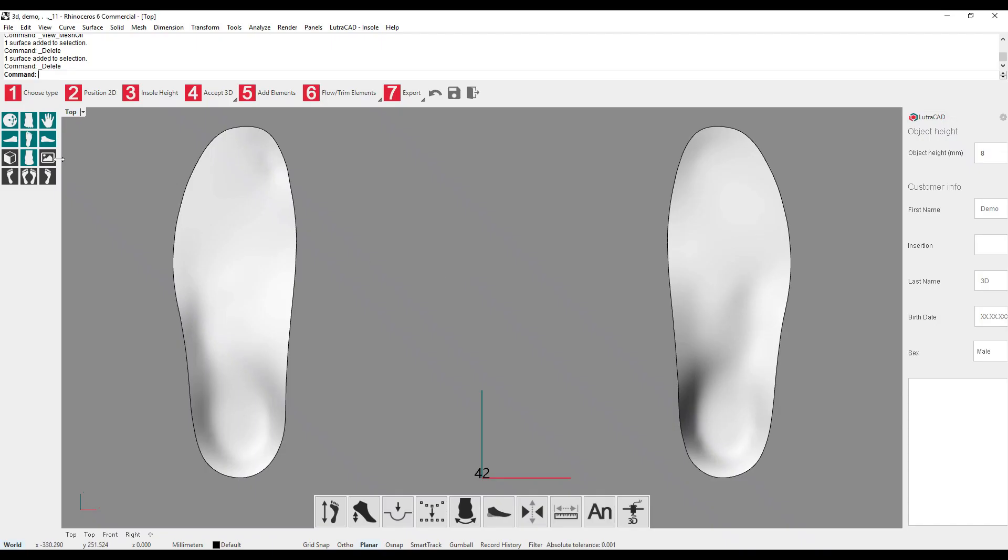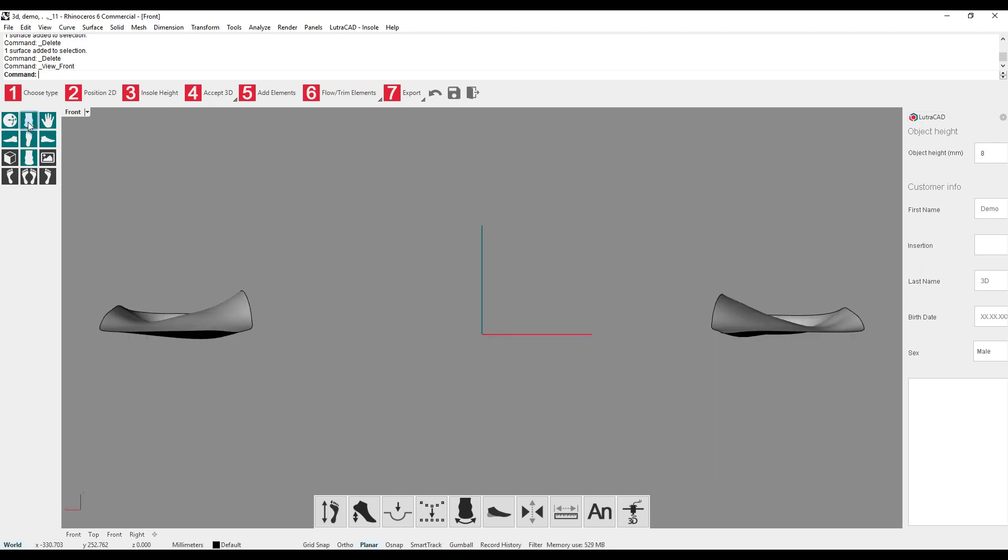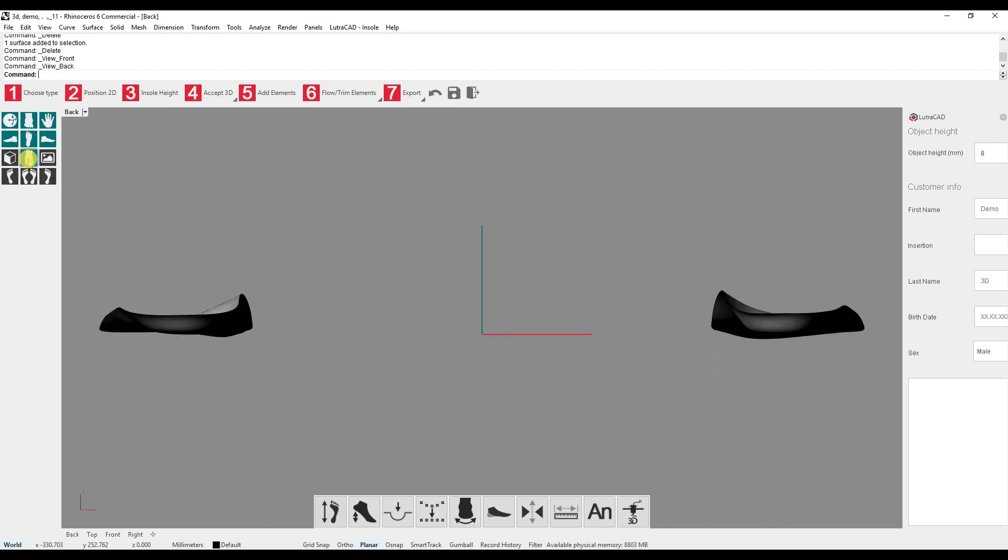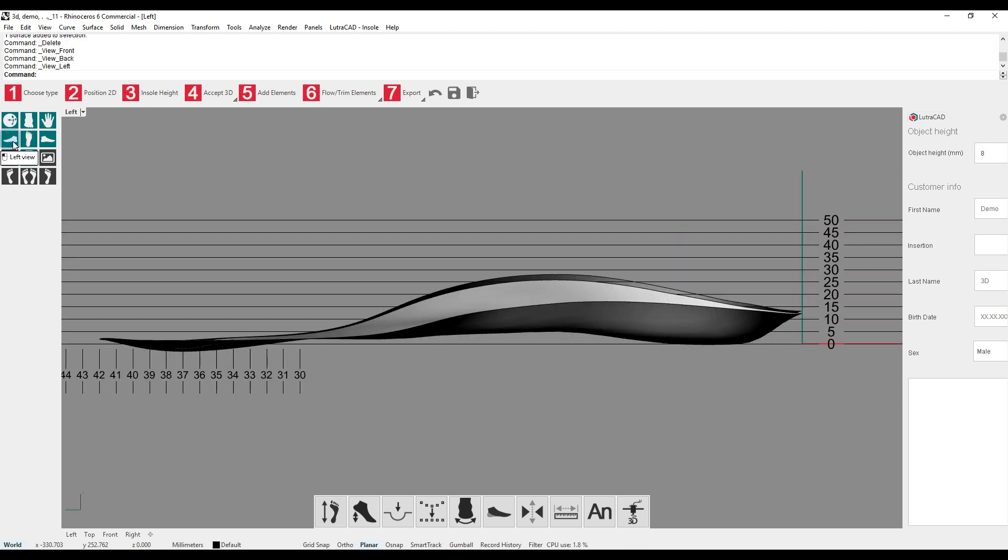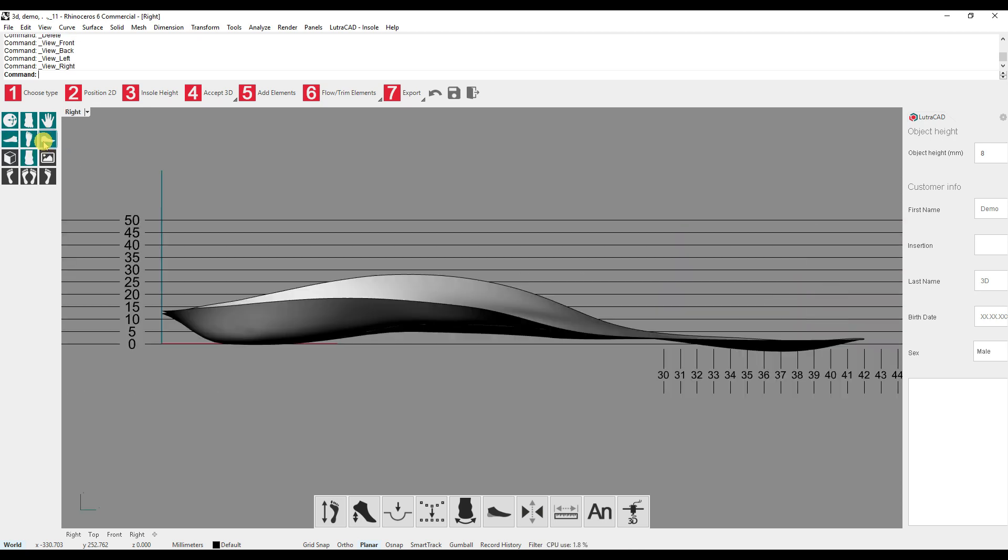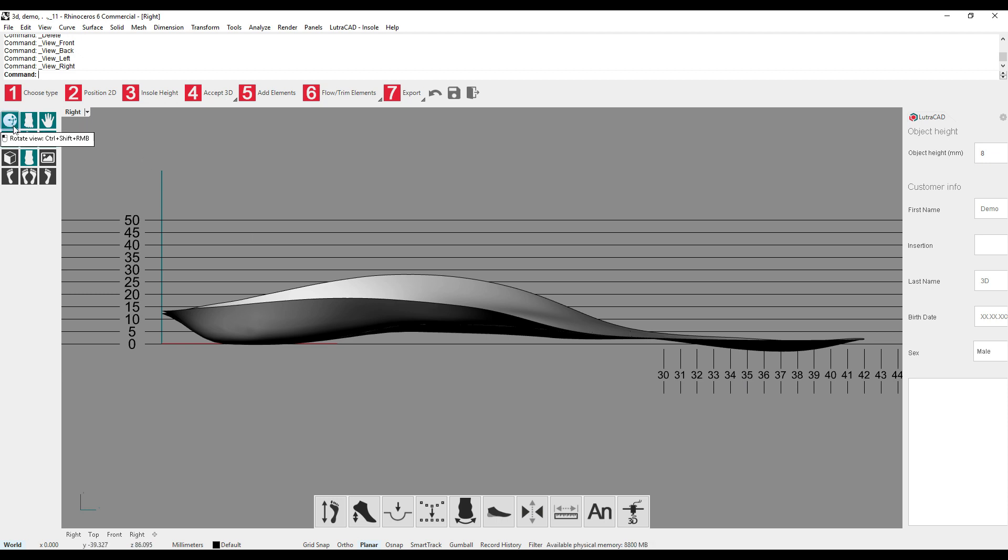Everything we can do with our view is visible on the left-hand side with the green buttons. We can view the insole from five different sides, the front and back, the left and right, where additional information is shown like the insole height and the shoe size. And last, we have the top view.